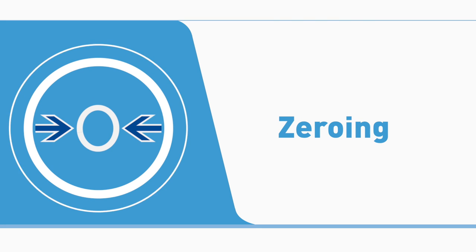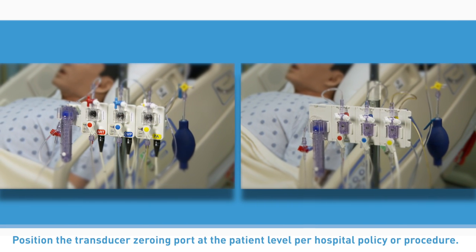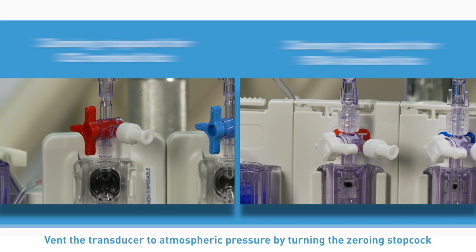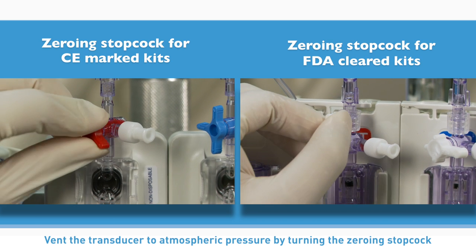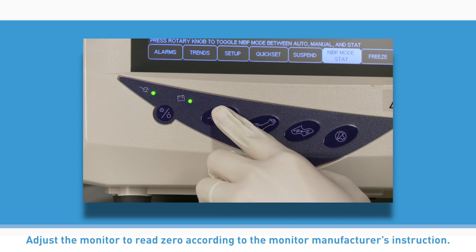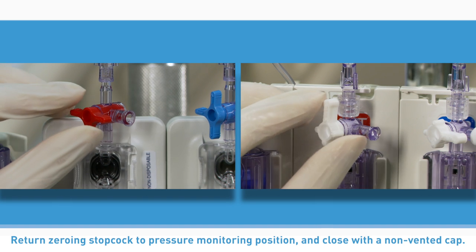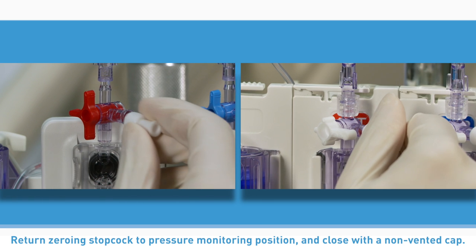Zeroing. Position the transducer zeroing port at the patient level per hospital policy or procedure. Vent the transducer to atmospheric pressure by turning the zeroing stopcock off to the patient and remove the non-vented cap. Adjust the monitor to read zero according to the monitor manufacturer's instructions. Return the zeroing stopcock to the pressure monitoring position and close with a non-vented cap.